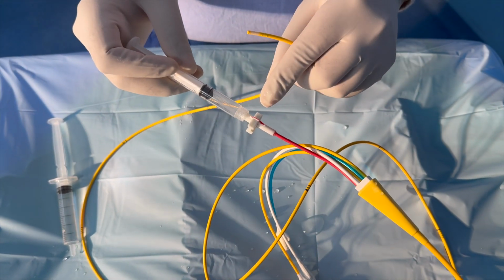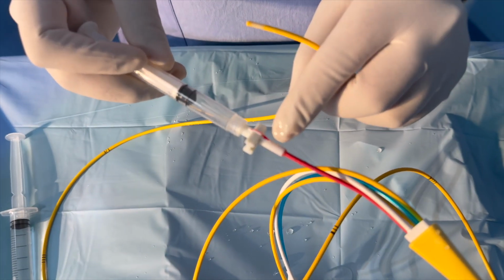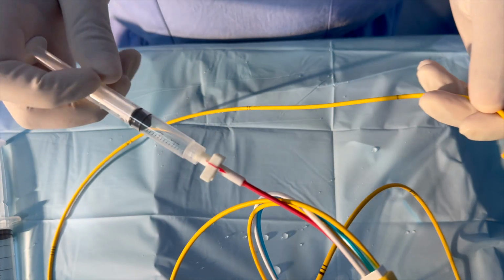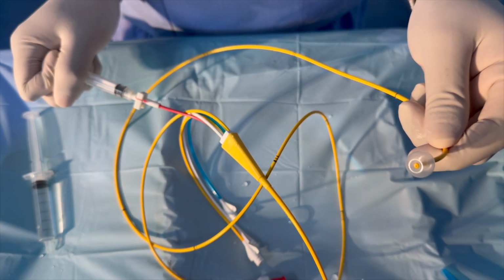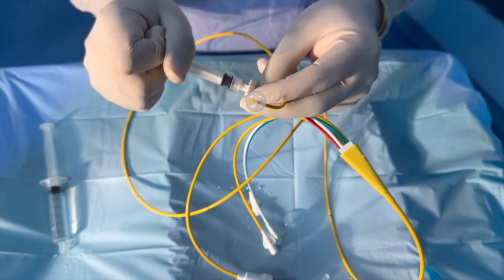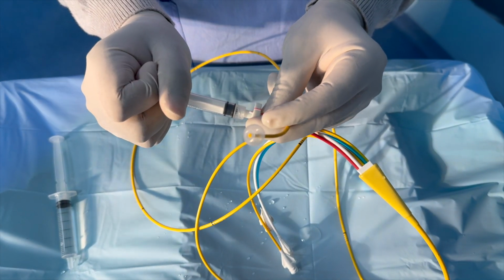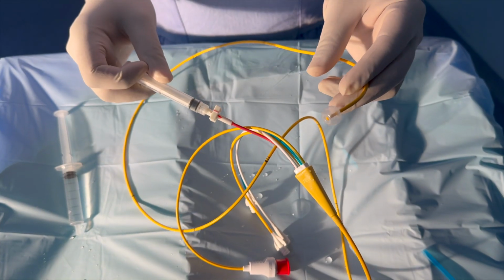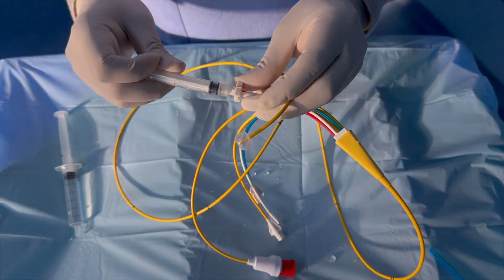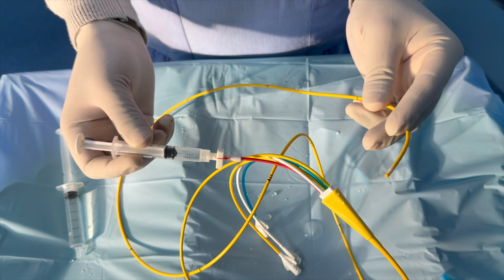Here you can see the red color marking. Above and below the red color marking should be in the same line. Then you can inflate the balloon situated at the tip of the PA catheter. It has a lock system. When you push this on the opposite side, then it is locked and the balloon is still inflated. To deflate the balloon, you have to push on the same side, and then the balloon is deflated.